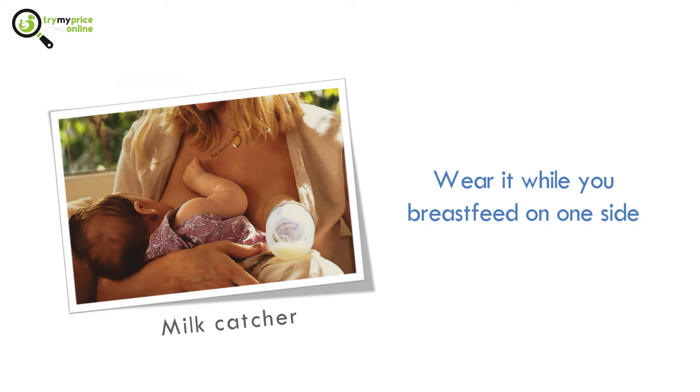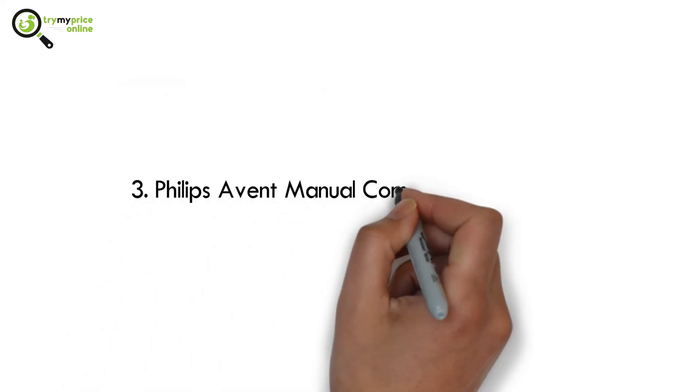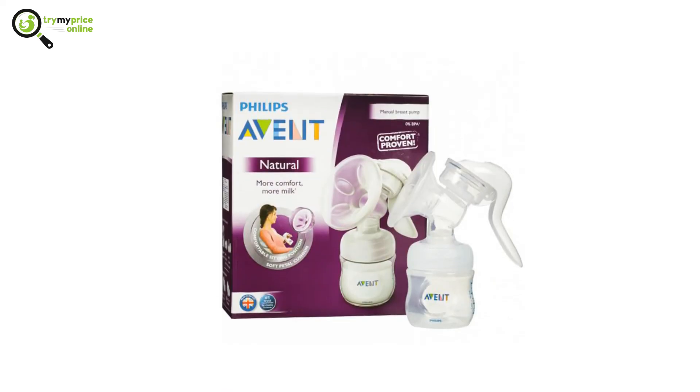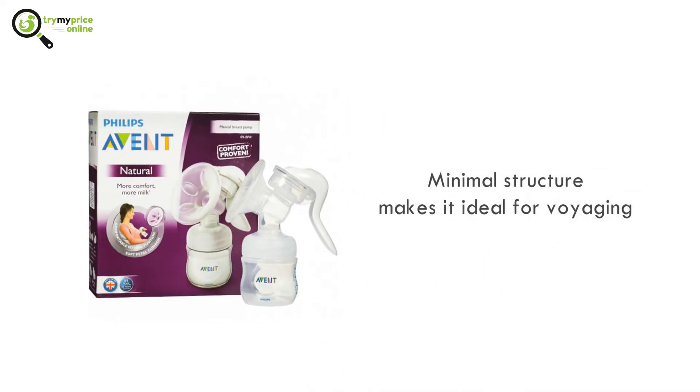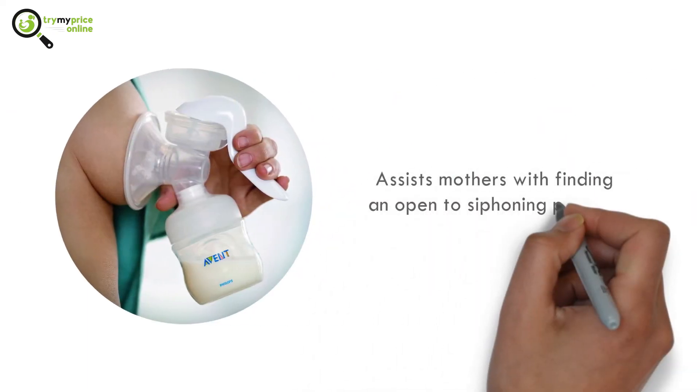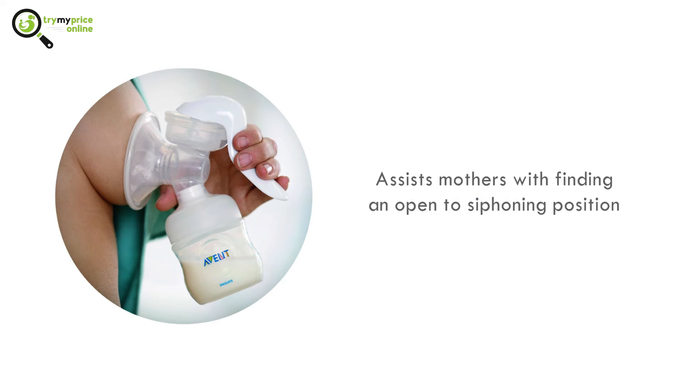Number 3: Philips Avent Manual Comfort Breast Pump. This pump is lightweight and its compact structure makes it ideal for traveling. It is designed to reduce hand cramps, which assists mothers in finding a comfortable pumping position.